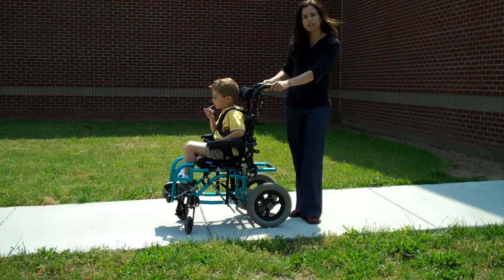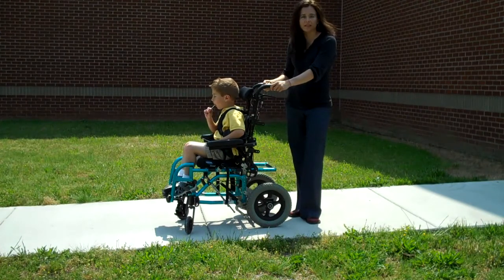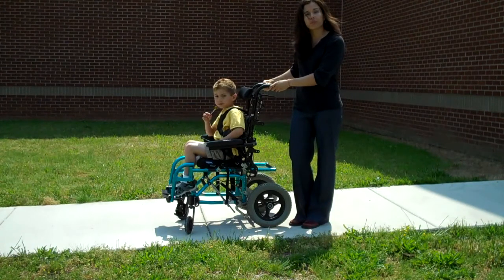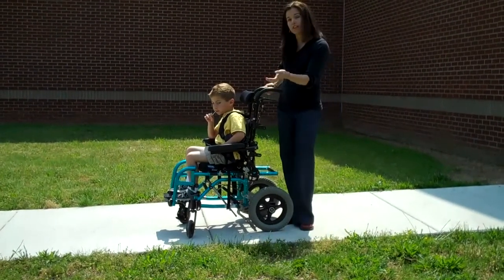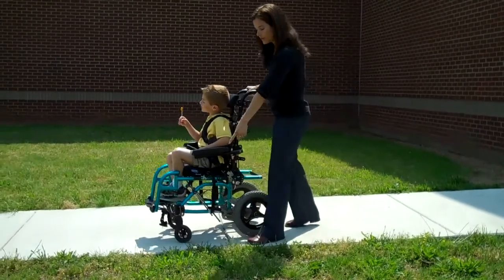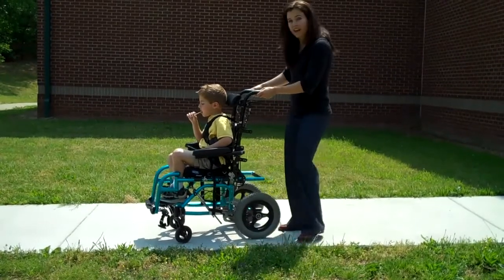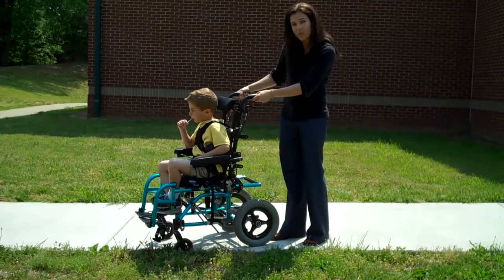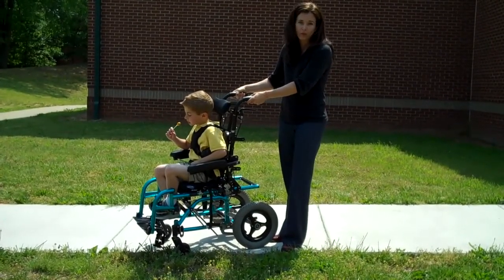It's time to take a look at some safety considerations for children traveling in wheelchairs during the school day. First and foremost, it's important to make sure that their pelvic positioning strap is securely fastened. When pushing on the sidewalk, you want to take care to make sure that you stay away from the lip where the concrete meets the grass. It's very easy to let that first caster roll off, and if that were to happen, it would be very difficult to maintain and keep the wheelchair from tipping over.